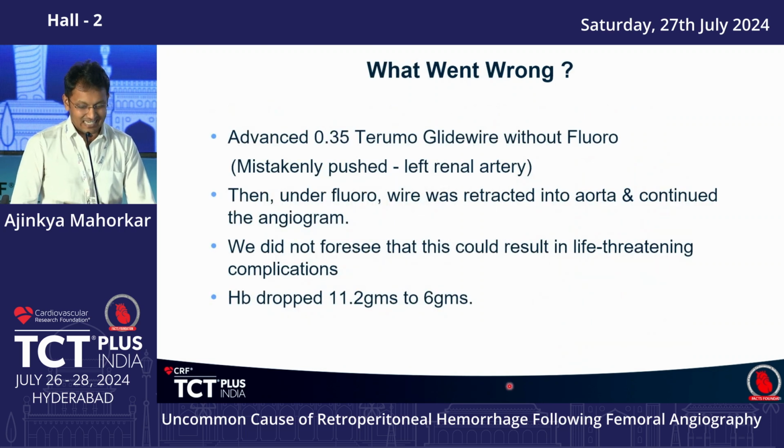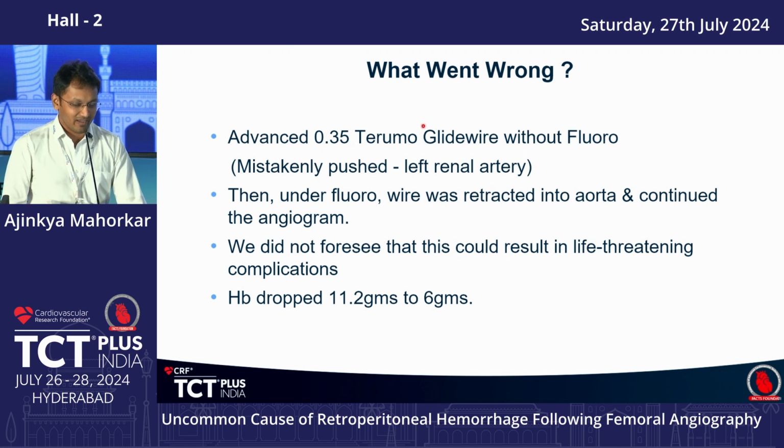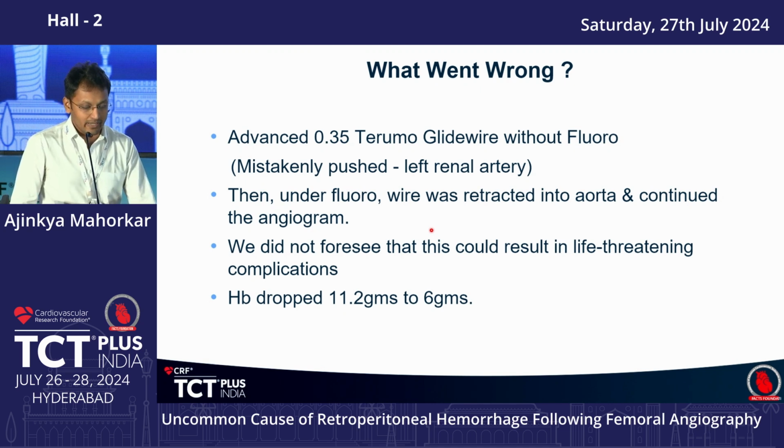Yes, yes. Exactly, sir is exactly correct. It was a glide wire, Terumo, hydrophilic, and we were not in fluoro guidance. And we mistakenly pushed it into the left renal artery, and then we fluoroed, we had resistance, we fluoroed and retracted it. Unfortunately, we don't have that cine of that time, and we did not even anticipate that this would cause such a life-threatening complication. We were not sensitized that this could happen by a Terumo wire.